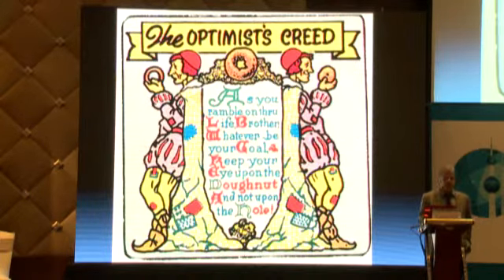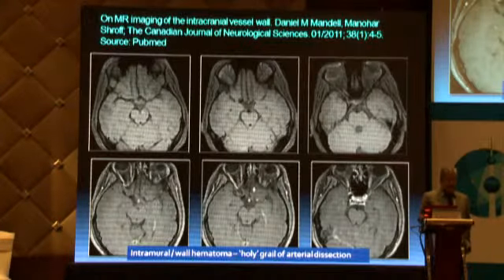And why do you think I'm talking about that? Exactly the question that you asked: when we think of vascular imaging, we think of the lumen, we think of the hole, whereas what we should be thinking of is the donut, the wall of the vessel. So as we now evaluate these abnormalities, we do more vessel wall imaging than ever before, and we have started thinking in the correct way of abnormality in the vessel wall, not in the lumen. Previously, we only did angiograms and thought that was the gold standard, but that is not true. You need both techniques to look at the wall, and the effect on the lumen is secondary.